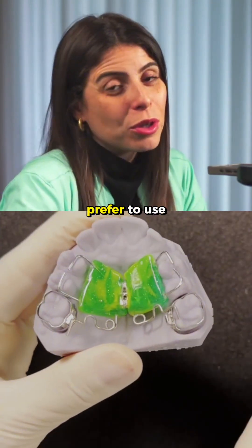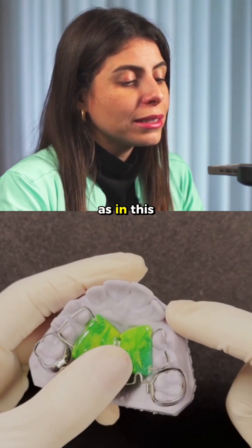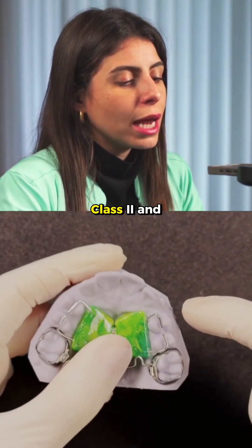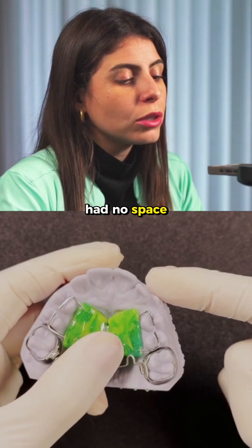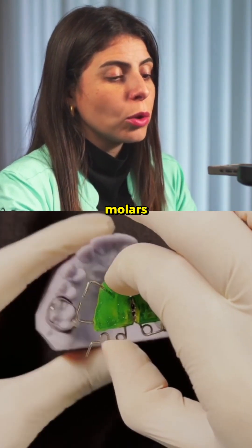In fact, I prefer to use it this way, but it can also be used for Class 2 treatment, as in this case of a patient who was Class 2 and had no space for the permanent canines. The purpose of these springs is to distalize the molars.